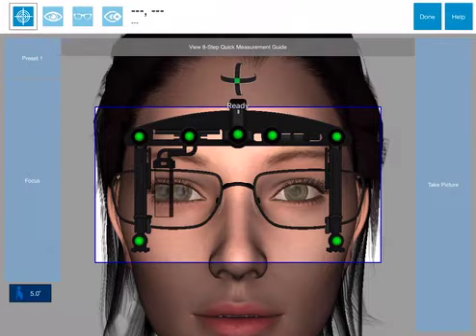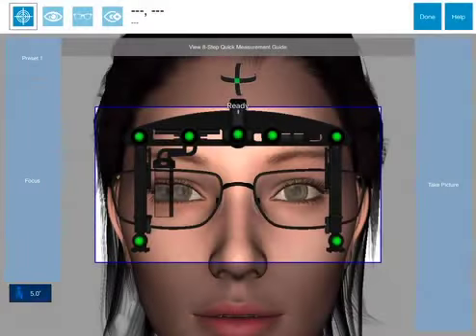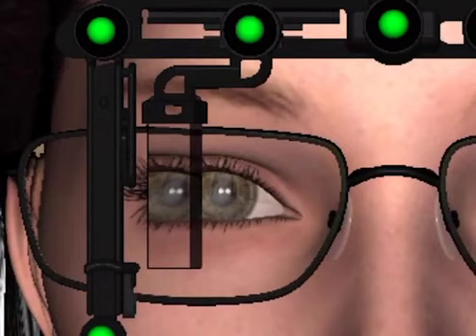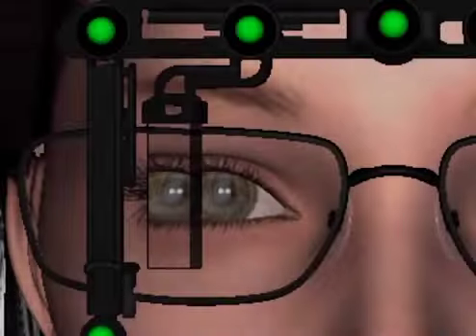While optional, the Focus button serves two important functions. It focuses a blurry live video and simultaneously triggers the camera flash, allowing you to verify that the prism is properly positioned with the corneal reflection clearly visible inside the prism.